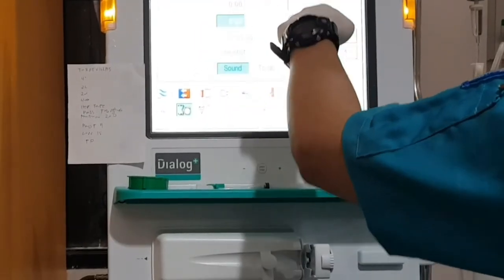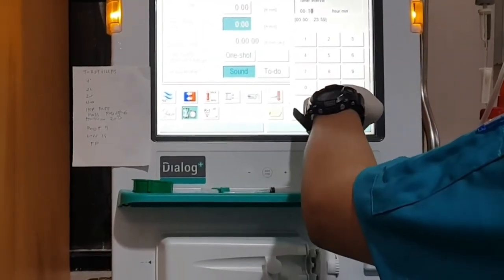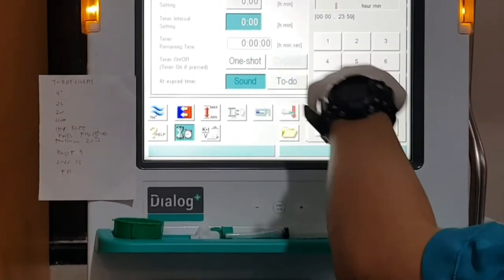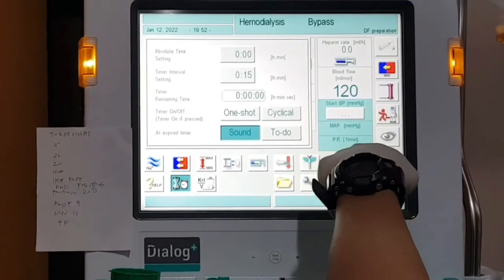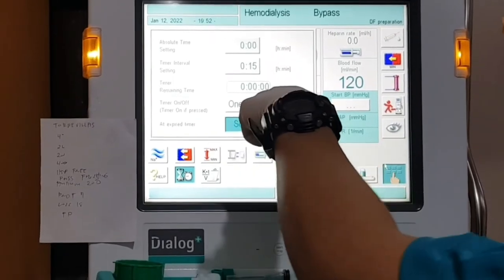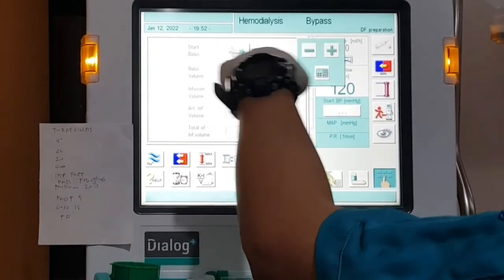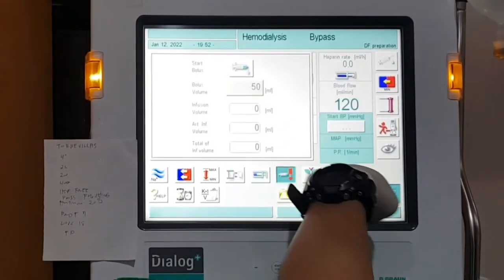The timer interval setting is where you input the cycle in minutes — here it's 15 minutes. The sound icon is highlighted meaning the sound alarm is already activated. Next is the arterial bolus icon where you input the bolus volume. Once everything is set, this is how you do flushing in the BeBraun machine.